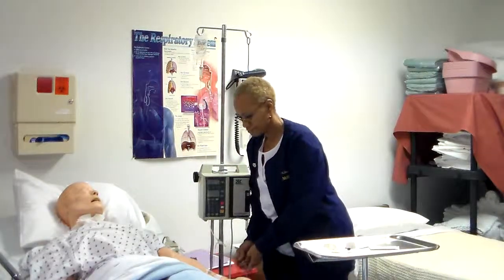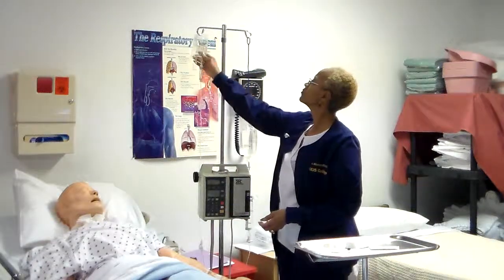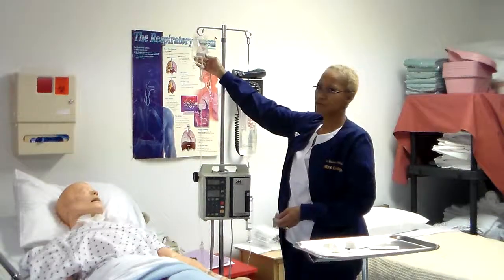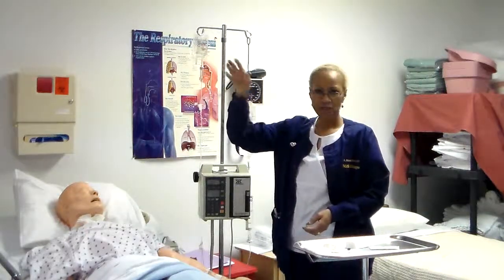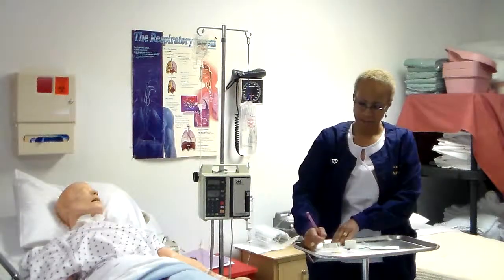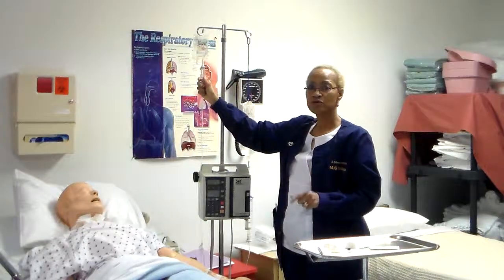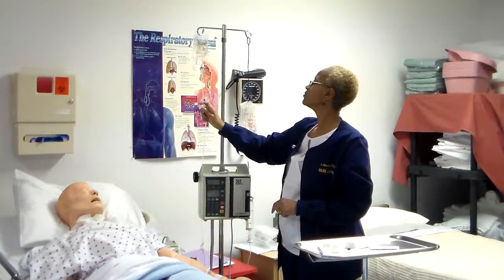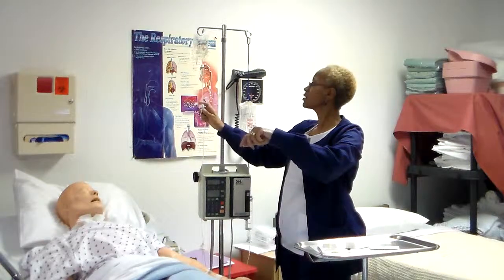Regulate flow rate of medication solution by adjusting regulator clamp. Infusion times vary. Refer to medication reference or institutional policy for safe flow rate. If this is a 50 milliliter bag and you want it to infuse in 30 minutes, you would do your calculations, and then you set your drip rate, and you will be given a calculation for your checkoff. And then you will count your drops. Make sure you have your watch.